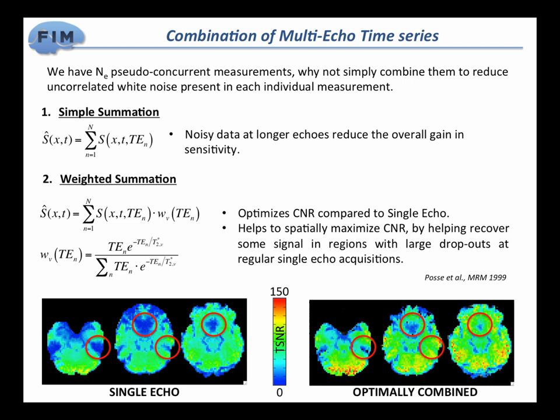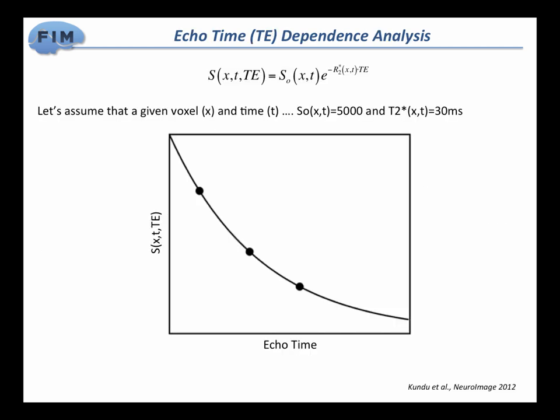The next more advanced way is what is the basis for MEICA. And the idea here is to do an echo dependence analysis. So are things clear so far?